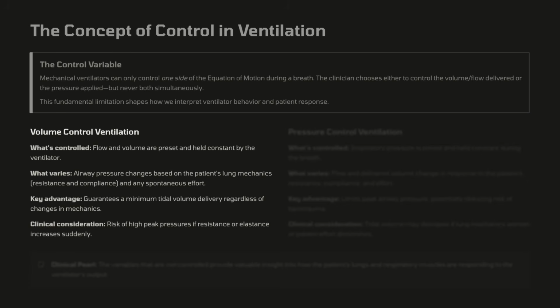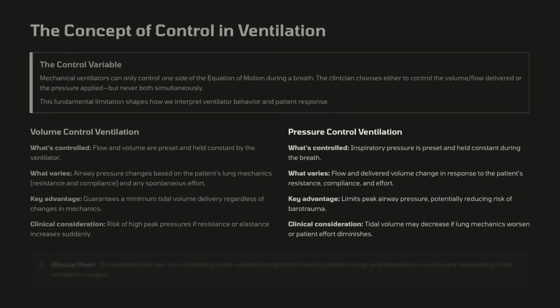The advantage is that it guarantees a tidal volume, regardless of how stiff the lung is or how resistant the lung is. However, it does have the risk of generating very high peak pressures if your elastance or the resistance is affected. Next is pressure control.